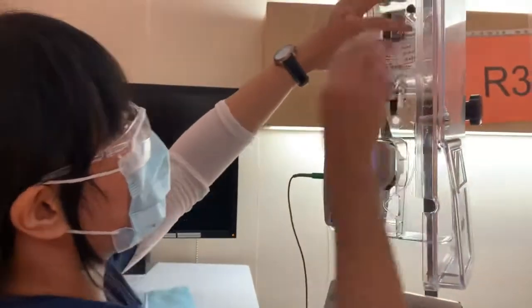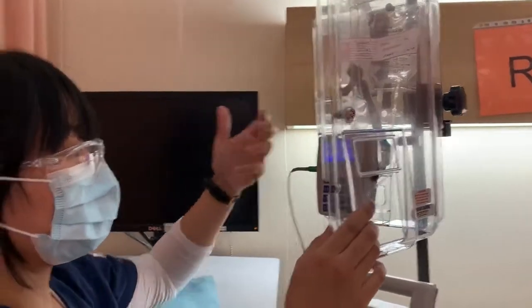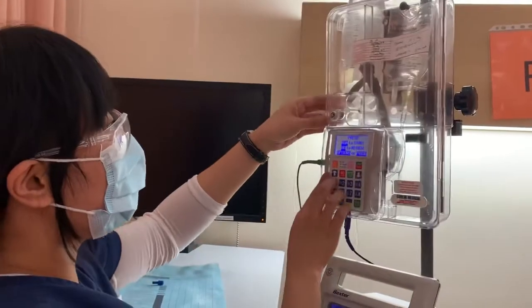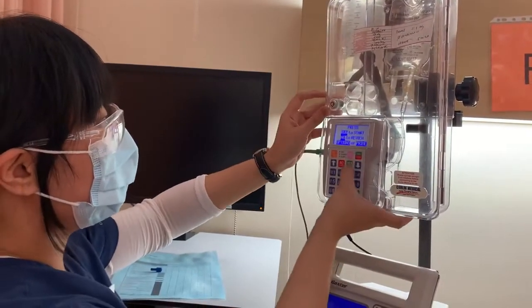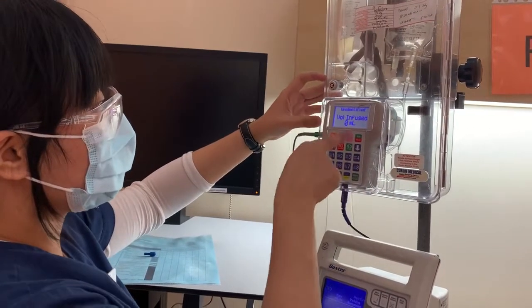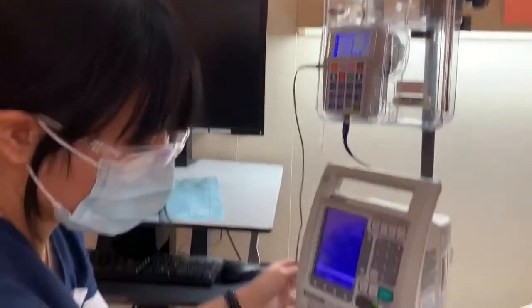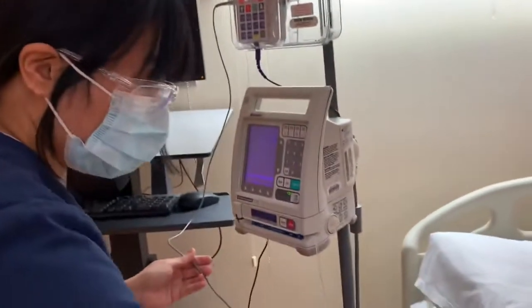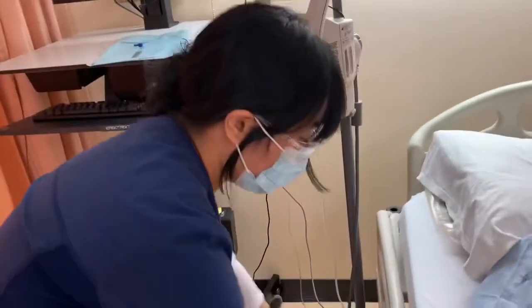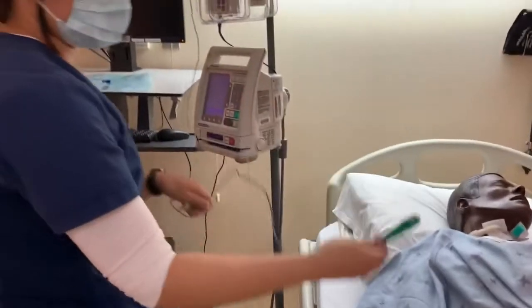So the protocol for a PCA would be we'll be checking the patient's vital signs every 4 hours, and we already did that as well. So now we're gonna lock it, close it, and we're gonna hit run right here. So there is the green light in there, so we know that it is working. And we make sure that everything is unclamped because it is running in TKVO, so we can really visualize the drips in there. So we make sure everything is unclamped. And the patient has the PCA button right here.